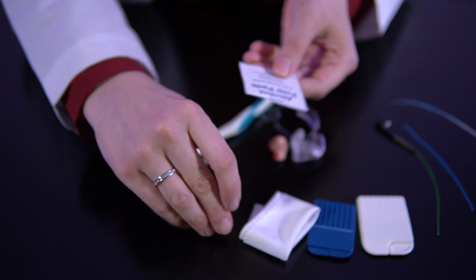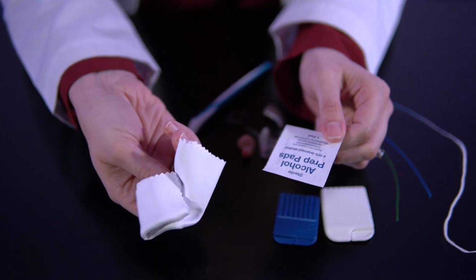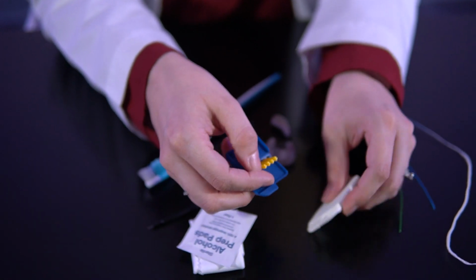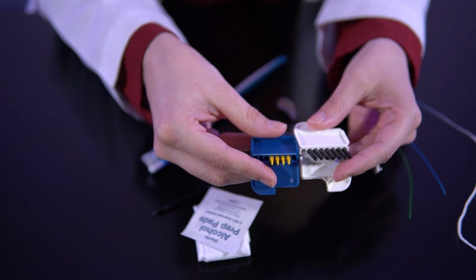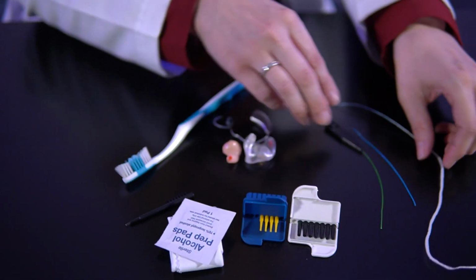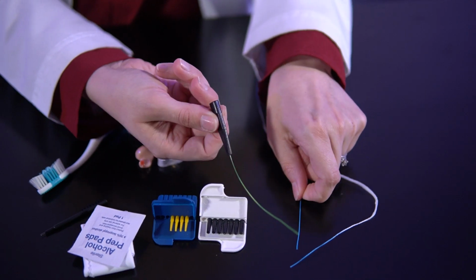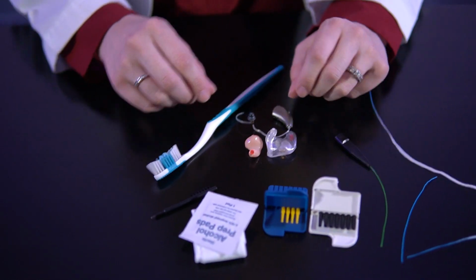I also like to use just an alcohol wipe or pad. If you don't have this, again, when you get your hearing aids, you do tend to get a little microfiber cloth. If you don't have either of these, a good old tissue will work perfectly fine. We also have our wax guards, or our wax filters is what we'll also call them. They come in a couple different styles, different colors, but they both do the exact same thing. Or you may even have a little disc shaped like ones. And then I've got a couple of other cleaners here. I really like to use this nano cleaner, but if you don't have this, again, a good piece of wire, whether it's fishing wire or just a good piece of string, will work just as well, okay?